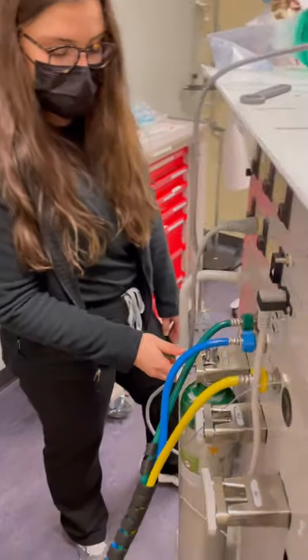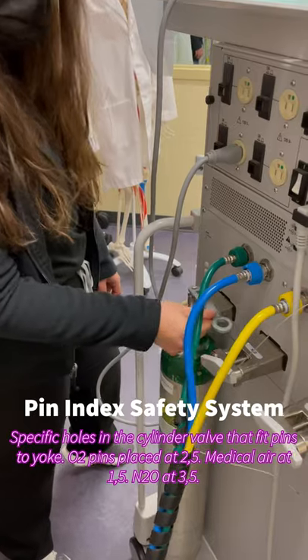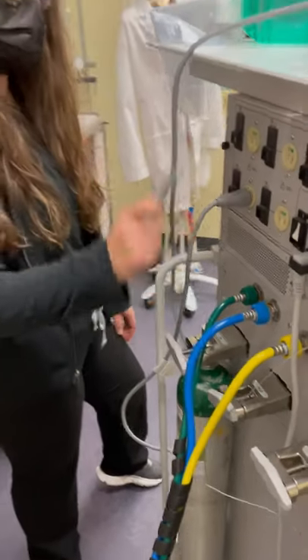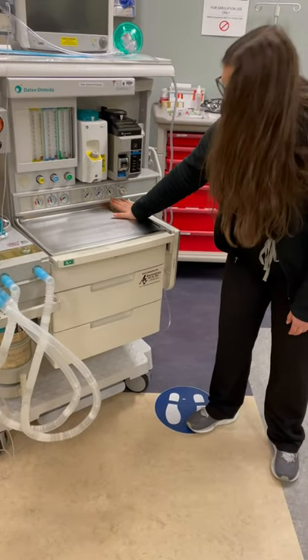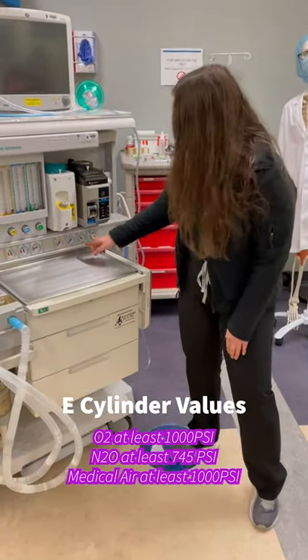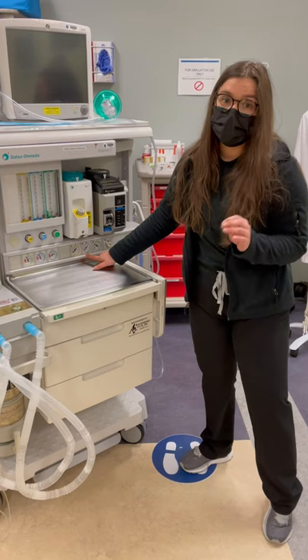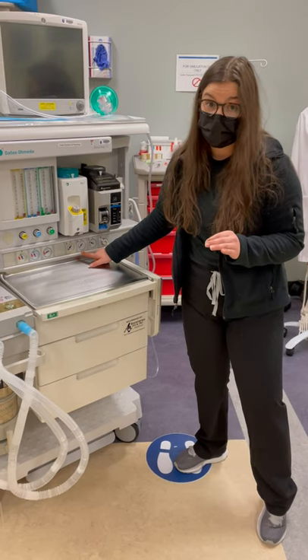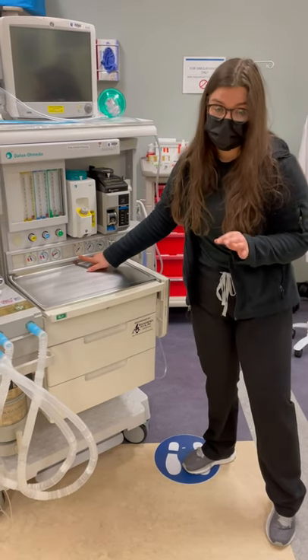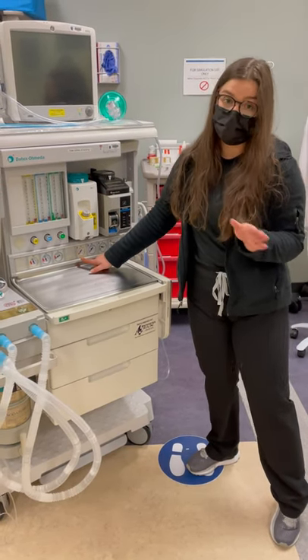This is your E-cylinder — it's hanging in a hanger yoke. The way I would crack this is slowly — can you hear that? — and then I would go ahead and close it because we don't want to use it. Coming to the front, we're going to make sure oxygen reads at least 1000 PSI. If it doesn't read over 1000 PSI, you need to change the E-cylinder. Same for nitrous oxide: you need 745 PSI, or if it's lower than 745 PSI, three-fourths of the tank is empty and you need to change your tank. Medical air needs to be over 1000 PSI as well to show the tank is at least half full.